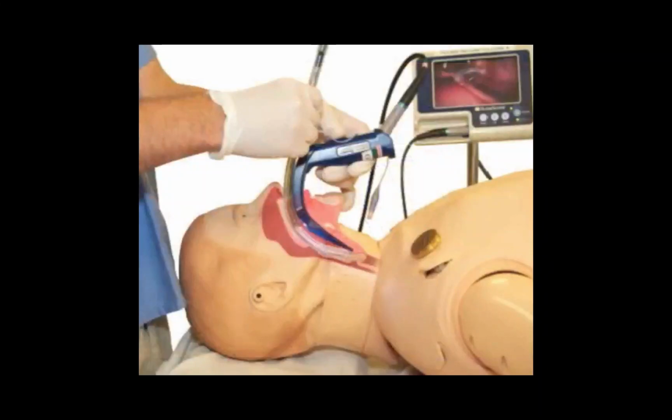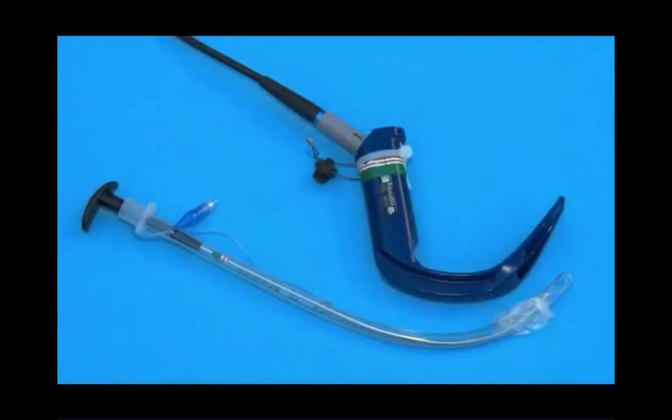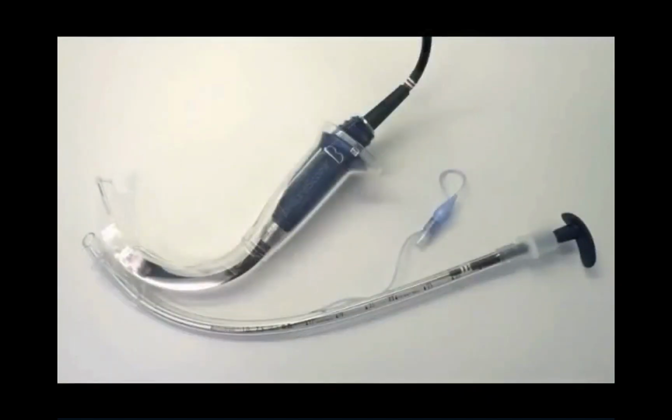The Glidescope video laryngoscope has become a popular tool in the management of the anticipated and unanticipated difficult airway. One of the main advantages of video laryngoscopy is that it allows other healthcare providers to visualize the airway and assist in intubation. The Glidescope is available with a detachable blade that can be sterilized and reused, as well as a single-use disposable blade that fits over a flexible wand. A Glidescope stylet has been specifically designed to facilitate alignment of the tip of the tracheal tube with the glottis.